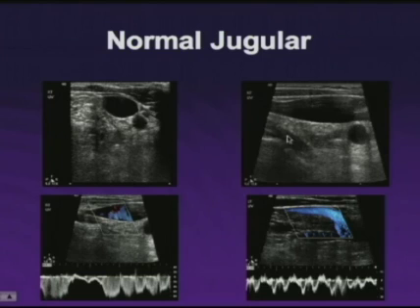Waveform shapes in the upper extremity veins are quite typical. We can see variation from phasic variation. Here you can see the vein nearly stopping and then going back to a more phasic change. We can also see that there is cardiac variation in this waveform.